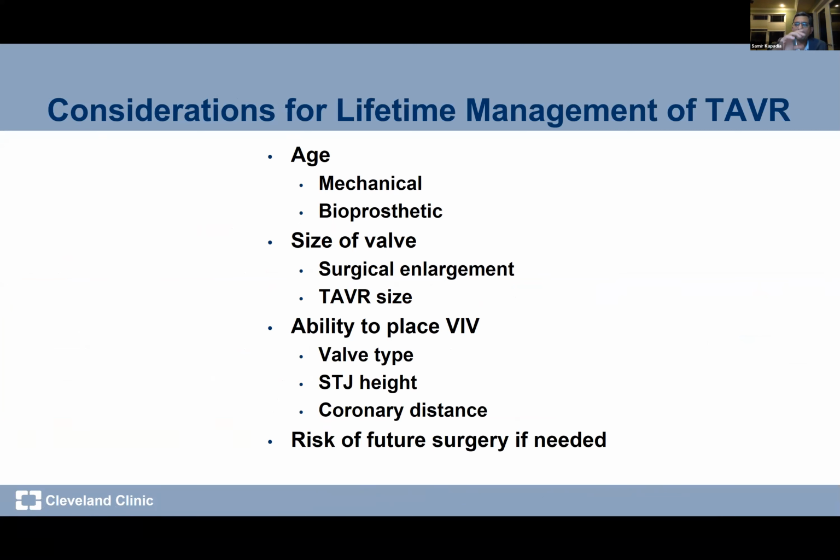So to say that if you have a patient, are you going to put a valve? Are you going to be able to do valve in valve in the future? So either TAVR in TAVR, or SAVR. Very important. So the first thing to know is that you do the age. If the patient is very young and if the mechanical valve, forget it, surgery is the best. If the size of the valve is important, then if they're small annulus, maybe TAVR is better.